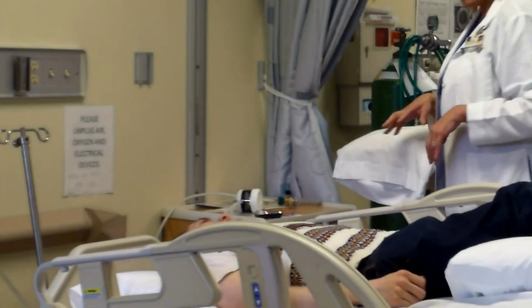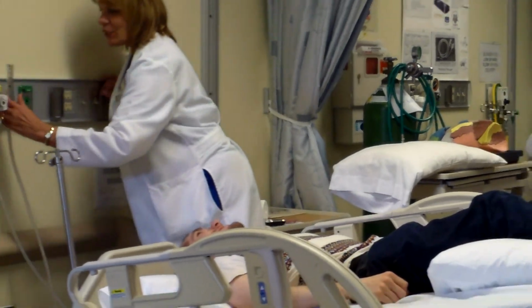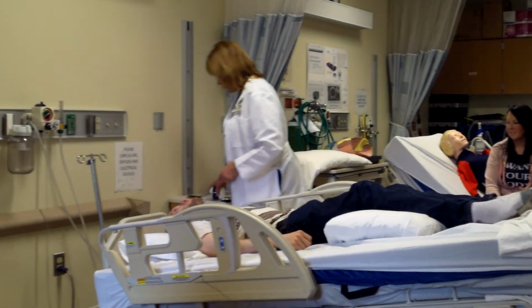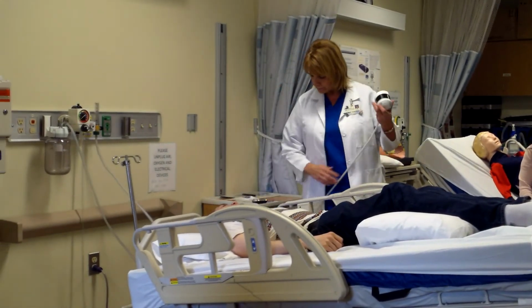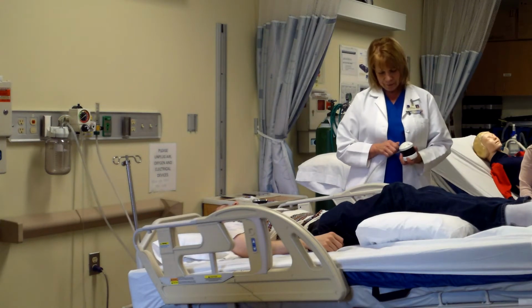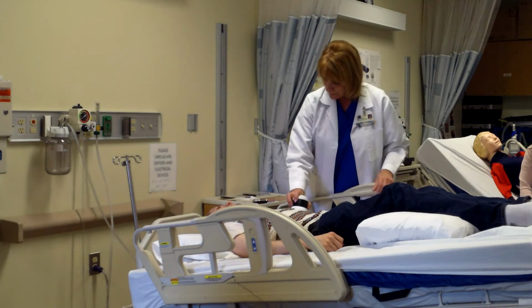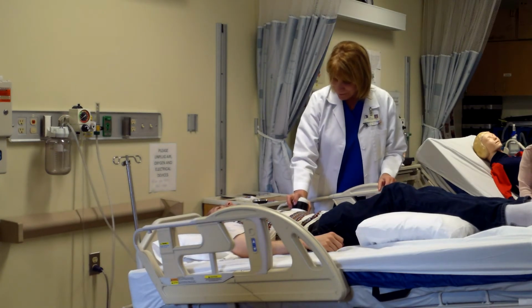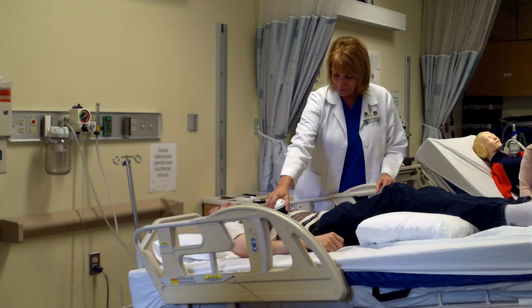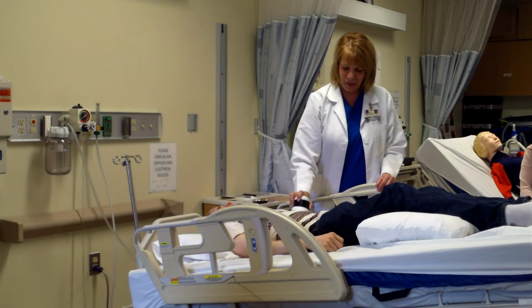Or we could do the massage. You're gonna like this. So this runs off of 50 psi. I've got my flow meter open all the way. Ready? You like that better? Yeah. Okay. That's a lot easier for me too. Patients love this.